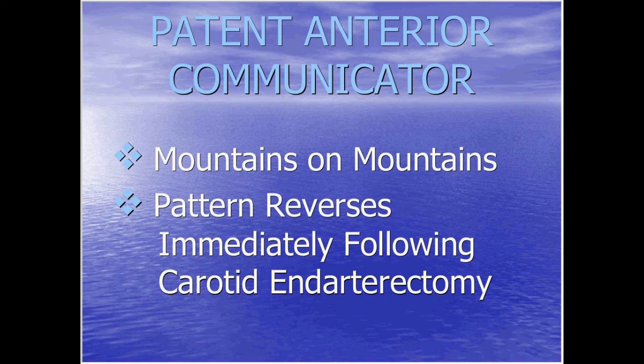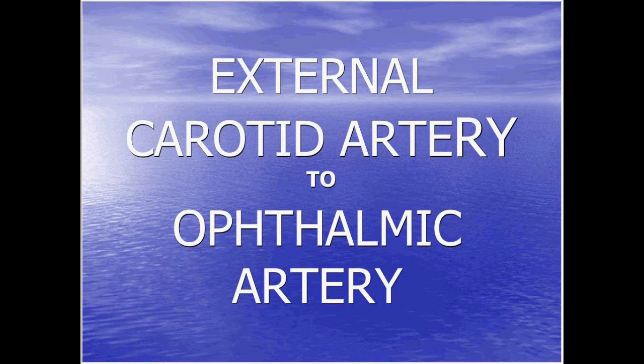Now, here is the peculiar thing. When the doctor goes in and they either put a stent in or they go in and endarterectomize this vessel, the anterior cerebral artery will completely reverse immediately. It completely returns to normal, okay? I didn't think that would happen. I thought it would take a couple days or something. No, it returns to normal immediately, which is kind of interesting to me. The body amazes me.